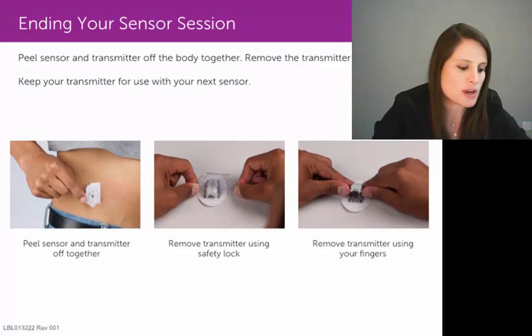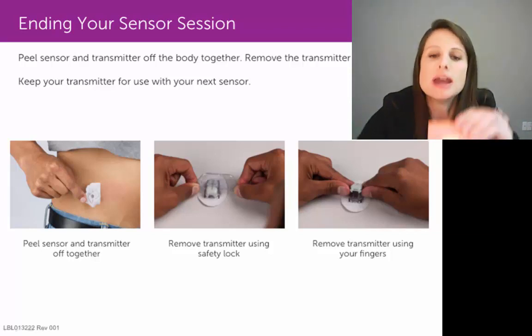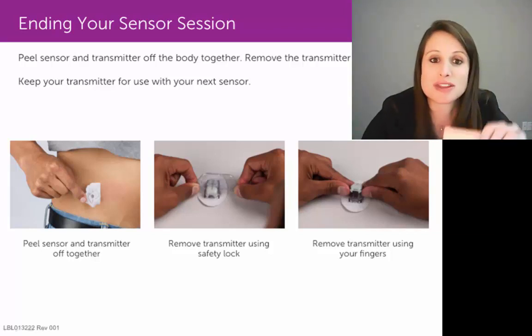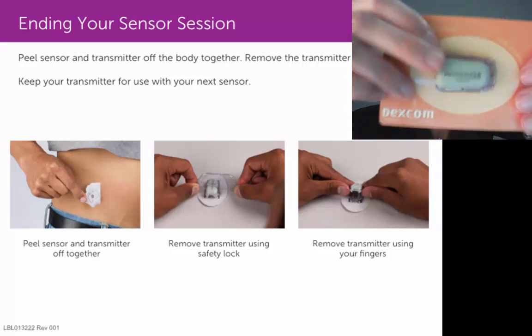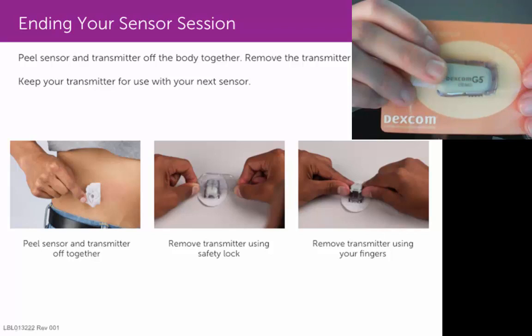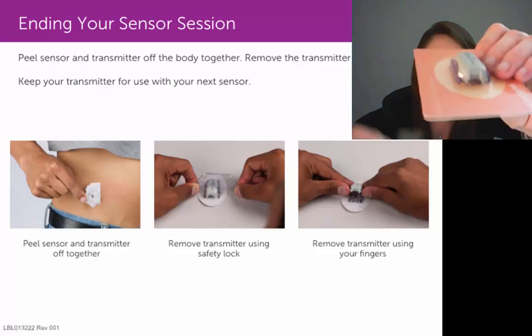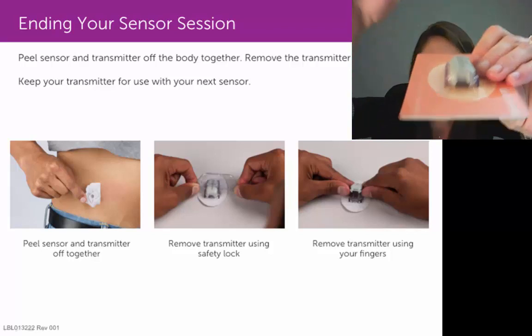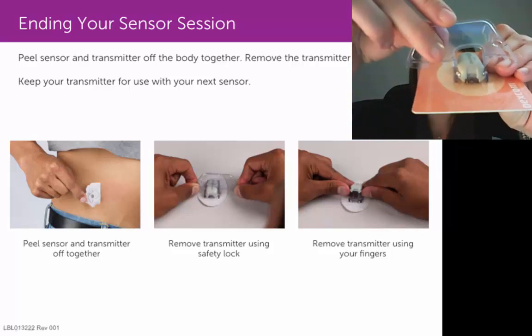Let me show you what that would look like. You want to make sure you place that sensor pod and transmitter on a hard surface in order to get this method to work. Looking at the D-for-Dexcom end, or the wide end of your transmitter — that's the side you would want to place that safety lock onto. Wrap that U-shaped cutout around the wide end of your transmitter.